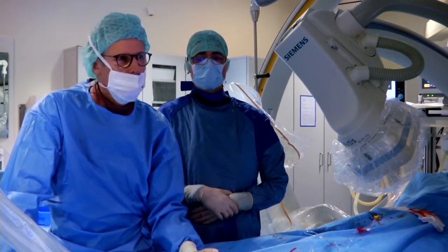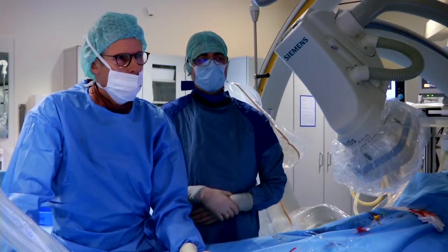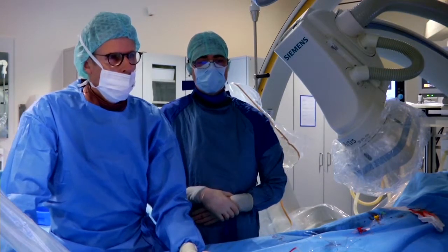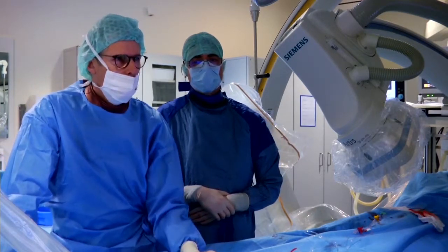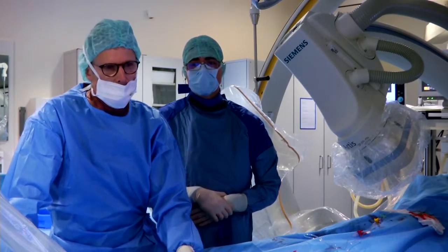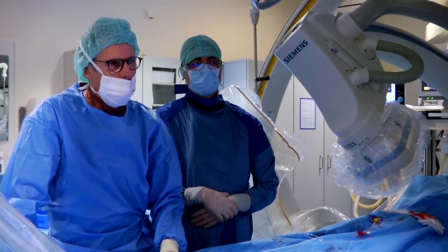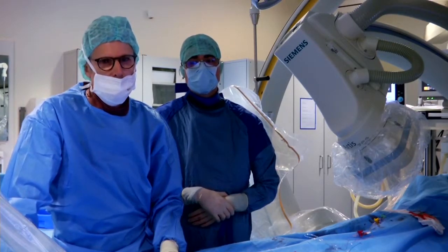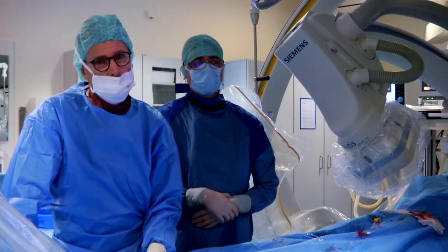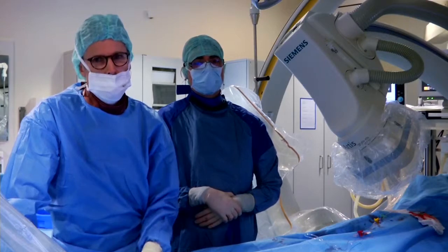In which direction you mean? Yeah, maybe we will take more soon at covered stent, for example, or what could be your plan? Well, of course, but with the covered stents, the child had only a few kilograms when we put in the stent, 12 kilograms. Talking about the future, the subclavian artery should remain open, so there are not so many options. And with the covered stents, I don't know whether we are able to overdilate them. And short covered stents are mostly relatively bulky, and you need perhaps 9 French or so for introduction. And yeah, I agree totally.